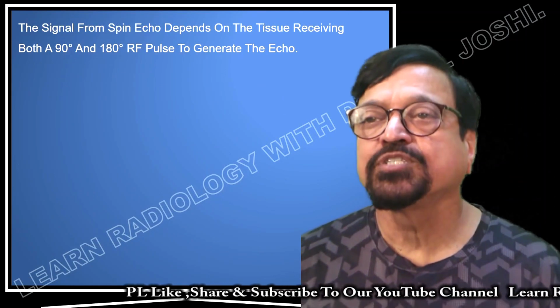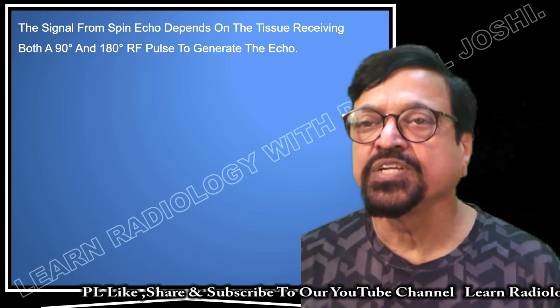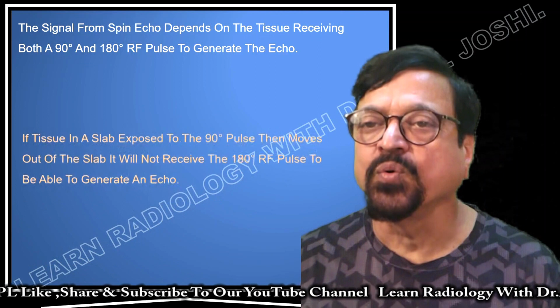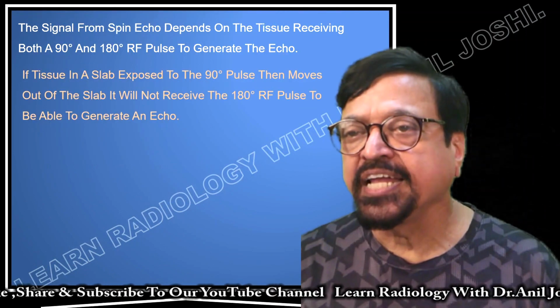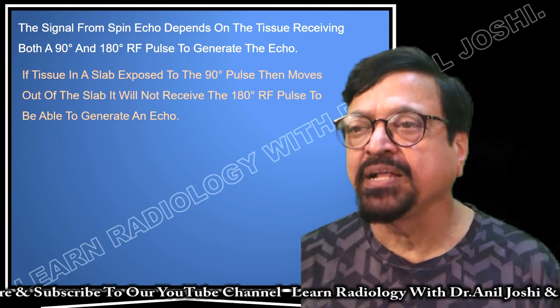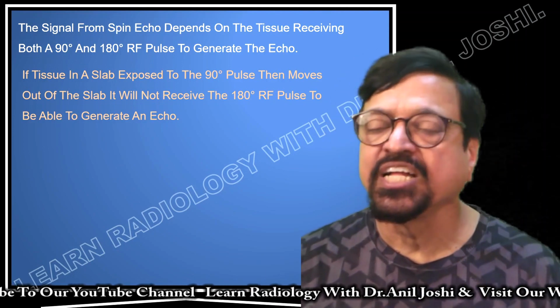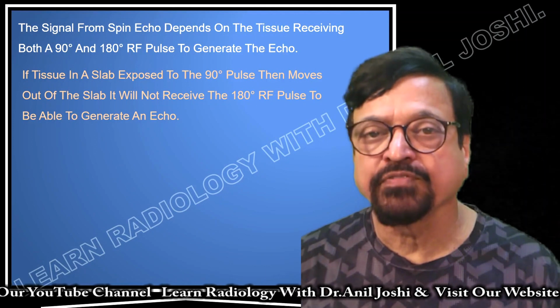The signal from spin echo depends on the tissue receiving both the 90 degree and 180 degree pulses to generate the echo. If the tissue in a slab exposed to the 90-degree pulse then moves out of the slab, it will not receive the 180 degree pulse. So, I have shown you in the diagram two types of tissues.